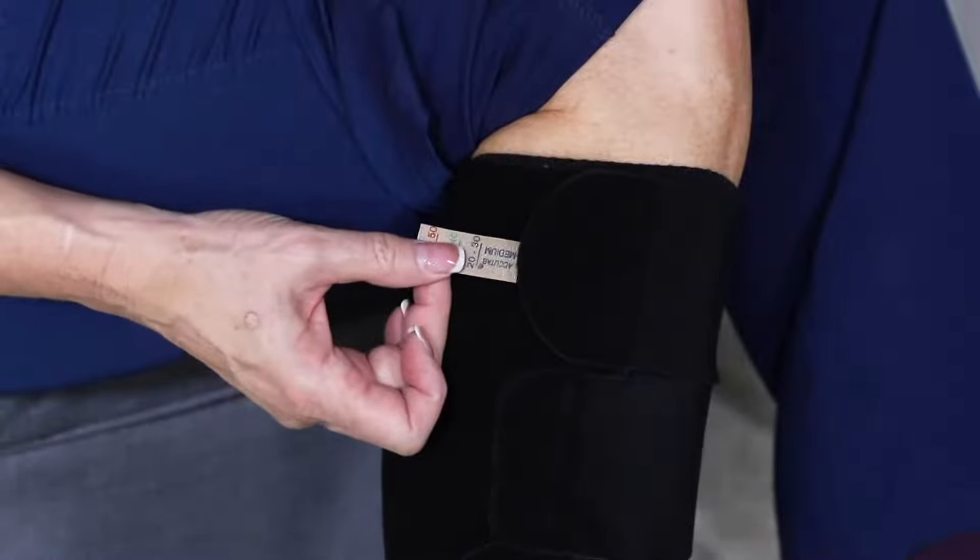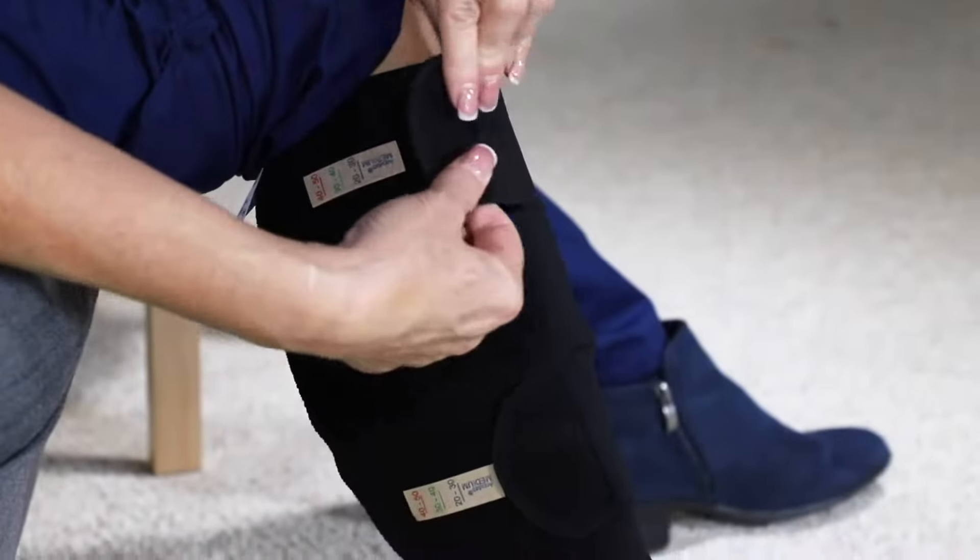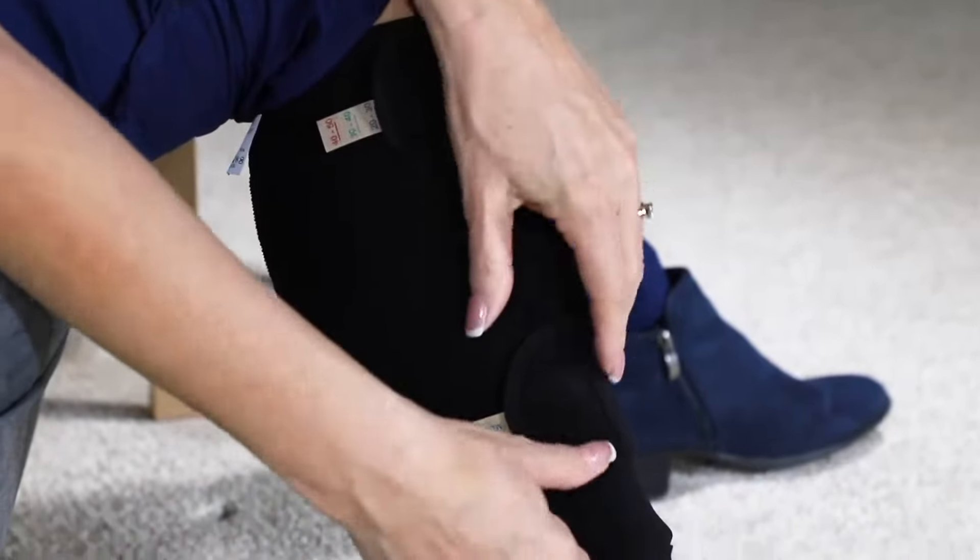Place one AccuTab device per strap as shown, making sure that the size and AccuTab print are facing the strap. Then apply each strap to the desired compression level.